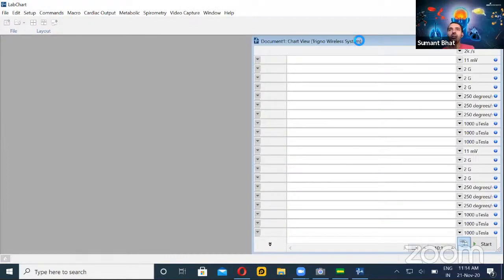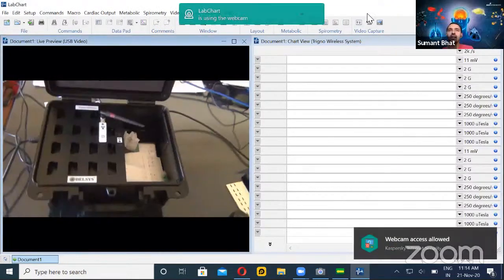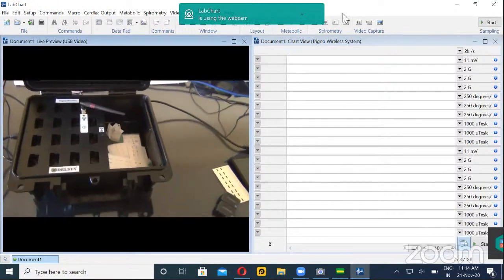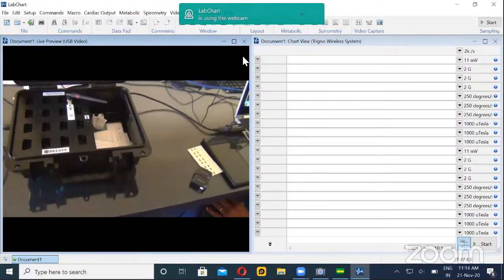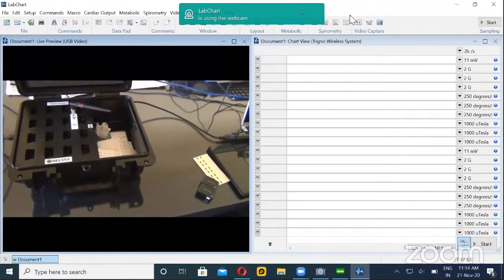This is a hands-on workshop, so if you have any questions in the middle, please feel free. Since it's a live workshop, there will be some lag time. Now you can see that I have connected my camera to the lab chart itself, so normally when you do the exercise, we can sync this video with the activity.